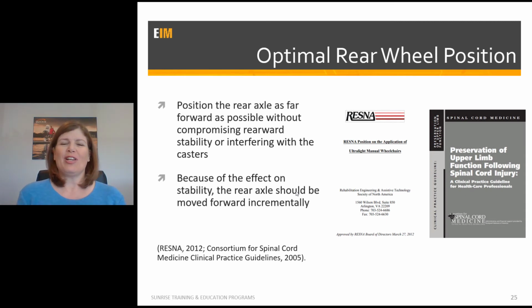Because if my rear wheel is too large and my caster size is large and I try to have that rear wheel as far forward as possible, some of my choices might be limited or I might have some interference with that front caster. And then again, some of the evidence is saying that perhaps what we should do with our clients, because of that instability that we have when that rear wheel is moved forward, is that perhaps that should be done incrementally so that that person becomes accustomed to the tippiness in the rear of the chair.